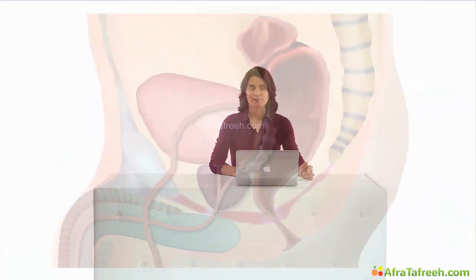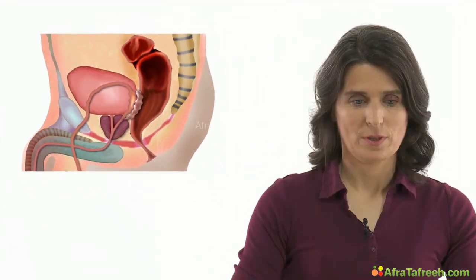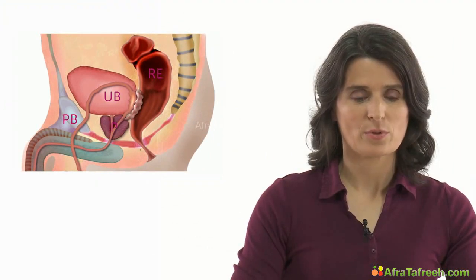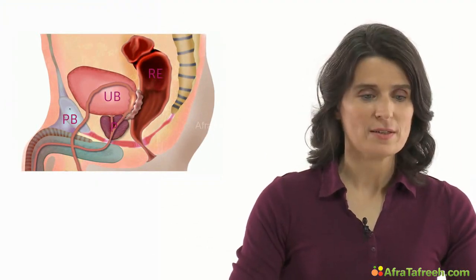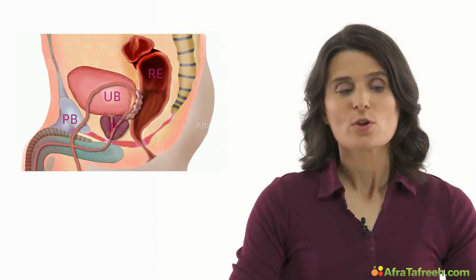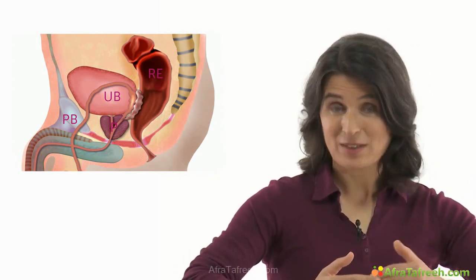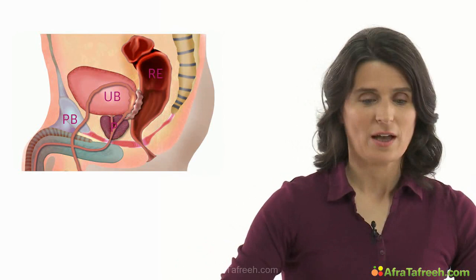The prostate is a small, nearly round organ seated in the male lower pelvis. It is directly adjacent to the urinary bladder, over here, and to the rectum in a posterior position to it. Here we can locate the prostate, and we can also easily see it is placed behind the pubic bone. So for us in performing ultrasound, this means we have to tilt our transducer behind the pubic bone, caudally, as we will see afterwards.